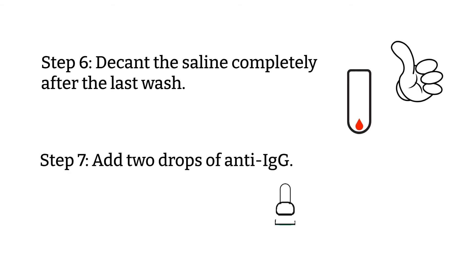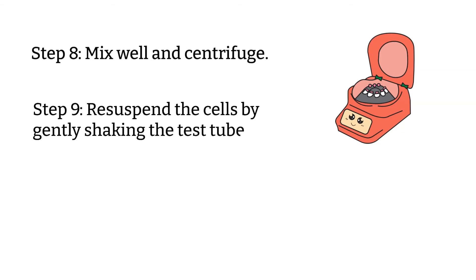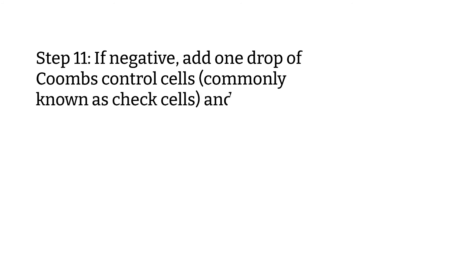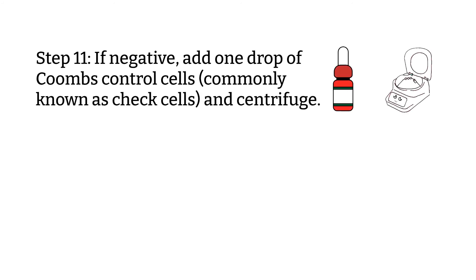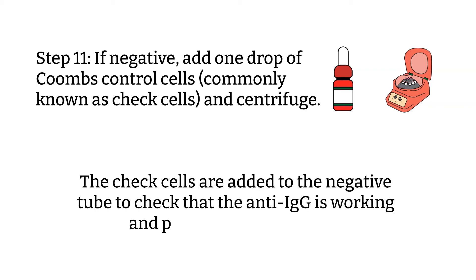Step 6: Make sure you decant the saline completely after the last wash. Step 7: Add two drops of anti-IgG. Step 8: Mix well and centrifuge. Step 9: Resuspend the cells by gently flicking the test tube. Step 10: Examine the agglutination. Step 11: If negative, add one drop of Coombs control cells, commonly known as check cells, and centrifuge.